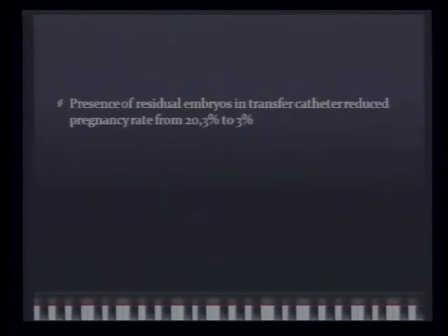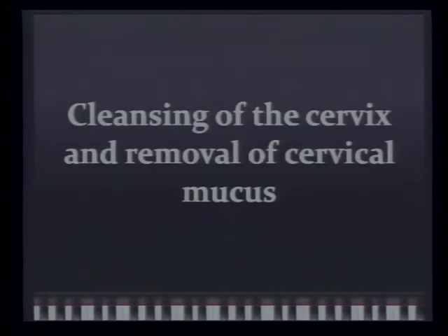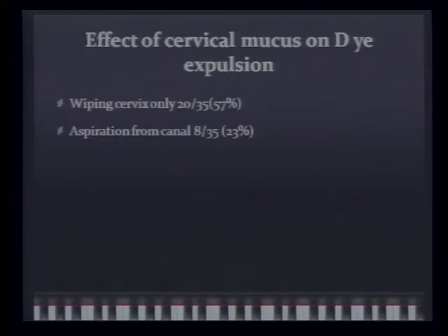Retained residual embryos in the transfer catheter reduce the pregnancy rate. It was discussed previously, so it is important. It has been told that soft catheters have an increased risk of having retained embryos in the catheters, but we'll see that. What about the cleansing of the cervix?